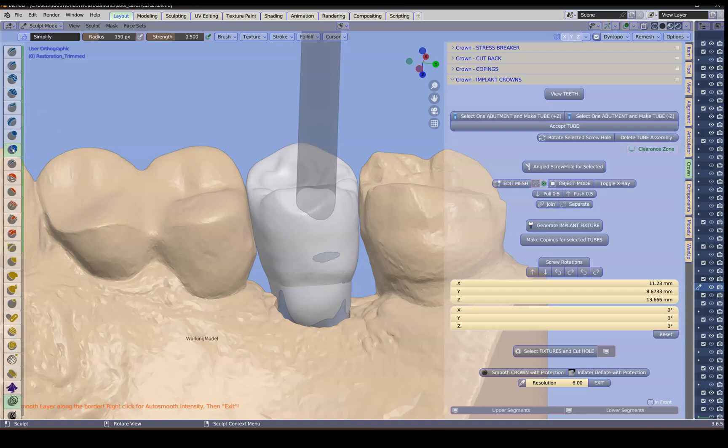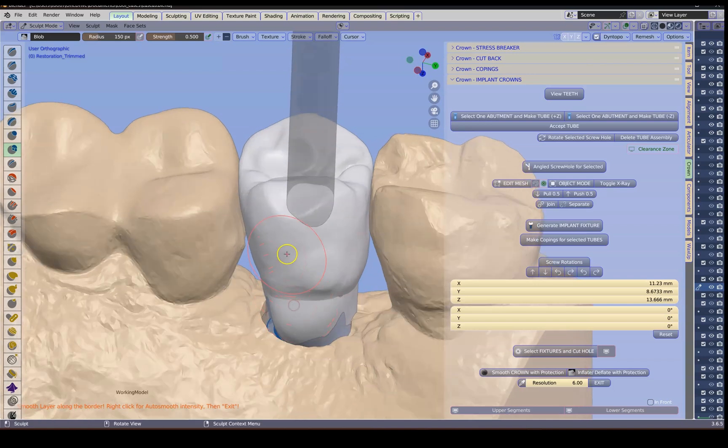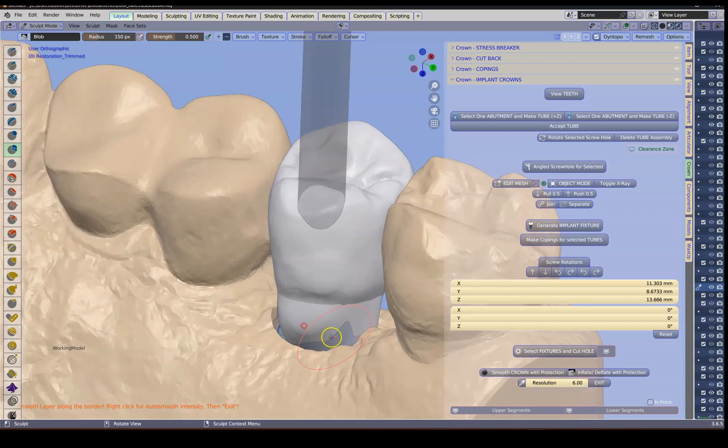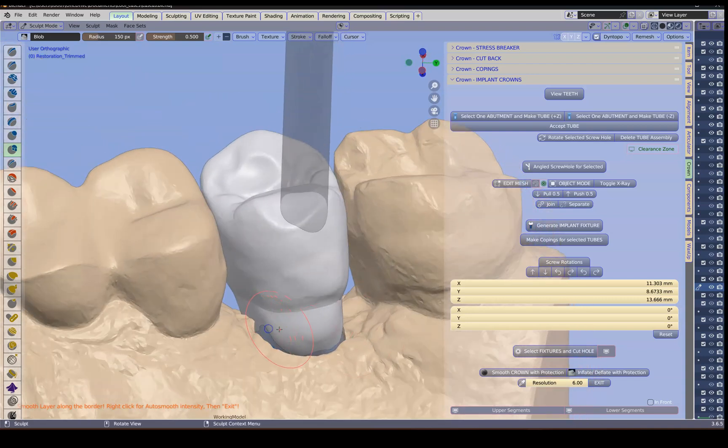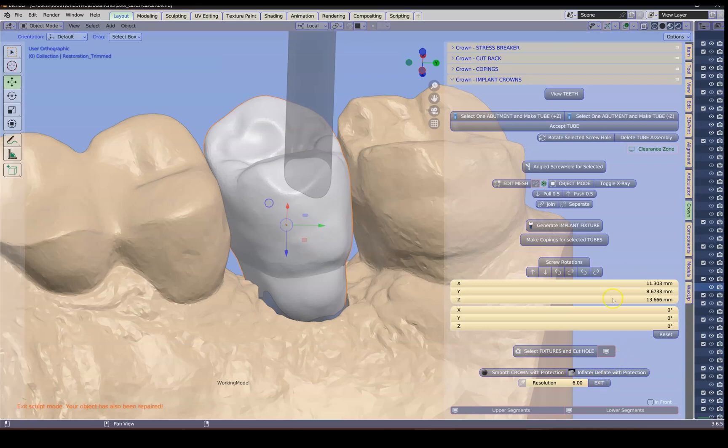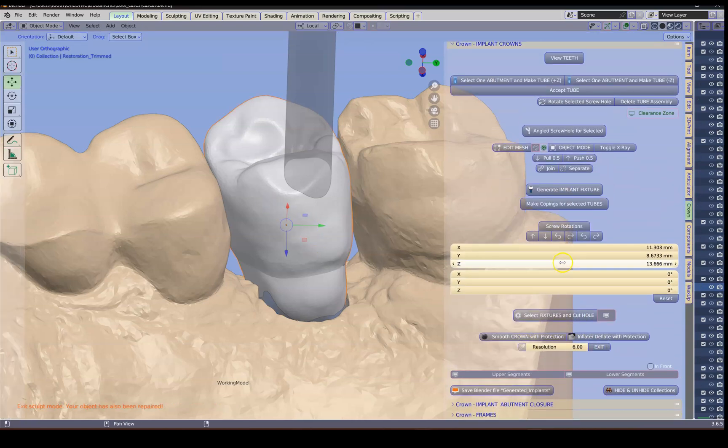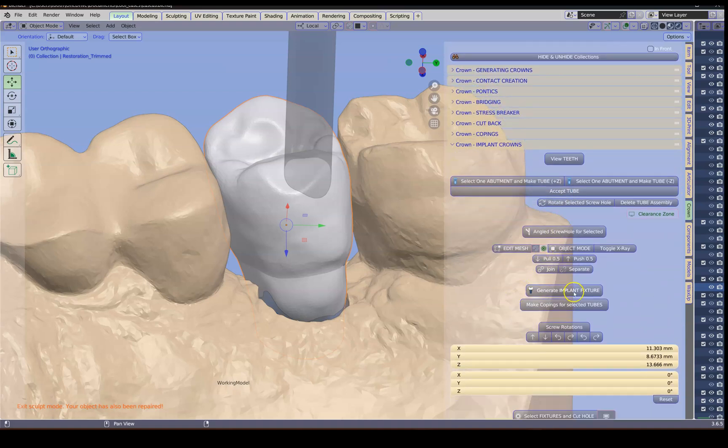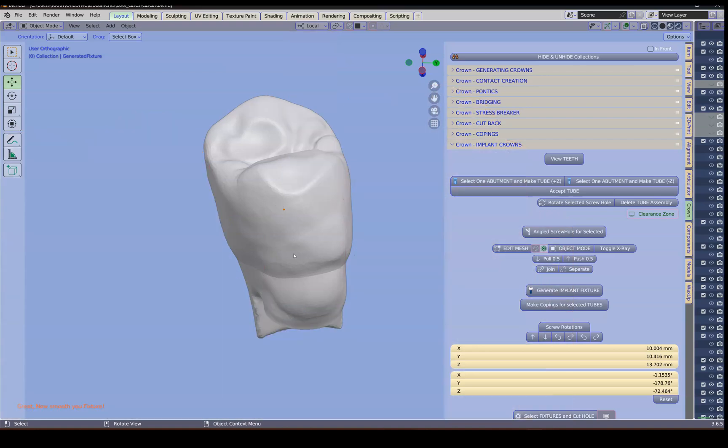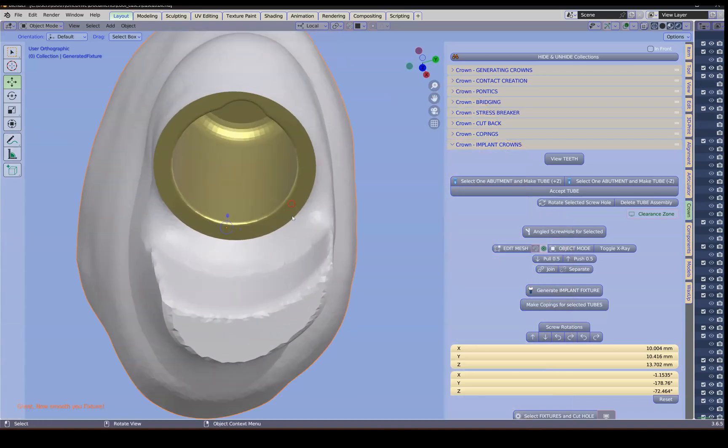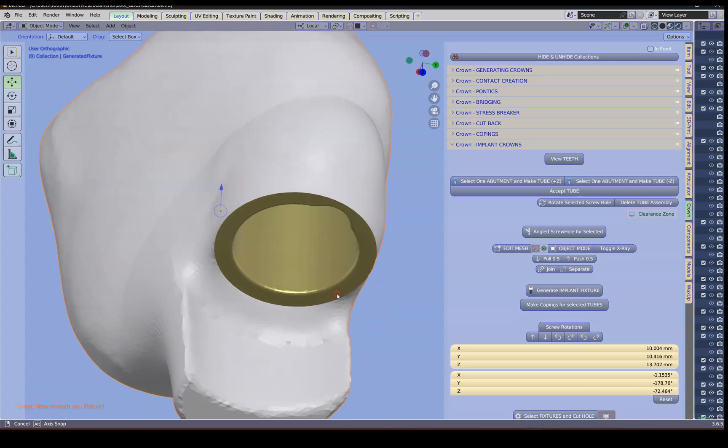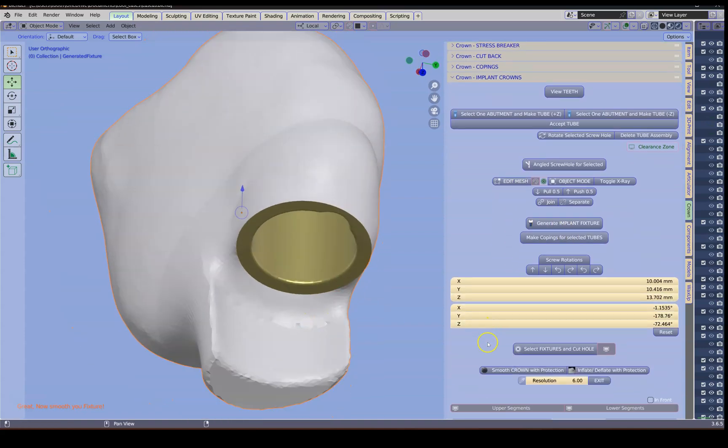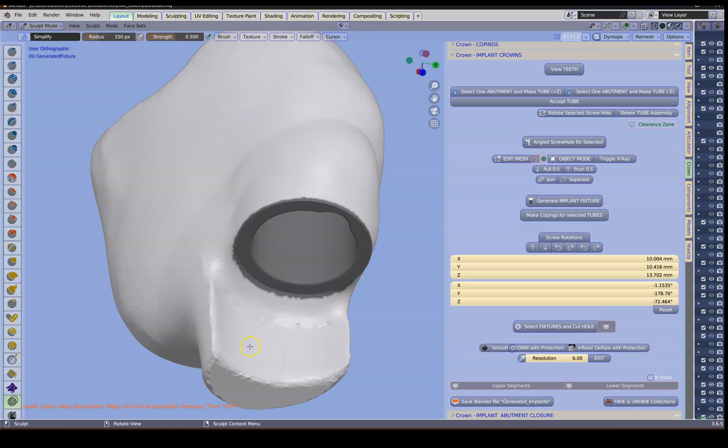I'm going to use this one over here which is like a blob tool. Be careful with the blob tool because it is actually quite aggressive. Select your crown and then generate the implant fixture. I'm going to view this. Control I to select the inverse and hide. And this is what it looks like. Now of course we'd like to smooth that down a little bit. Smooth down. And smooth that downwards.